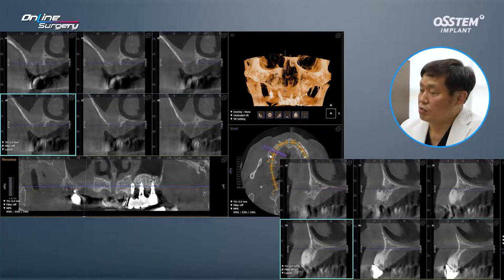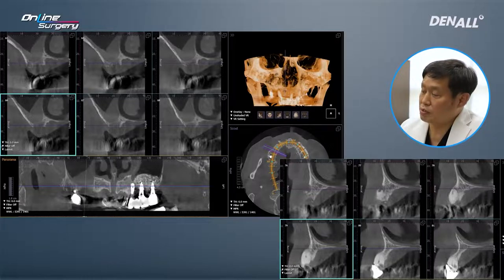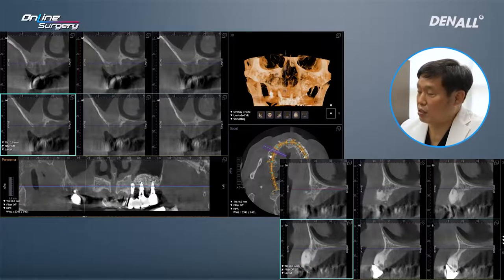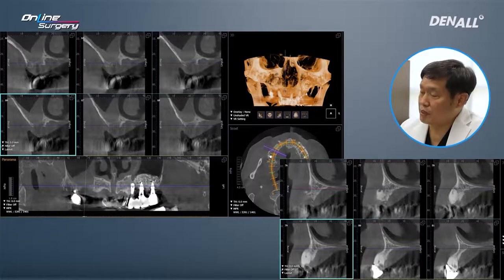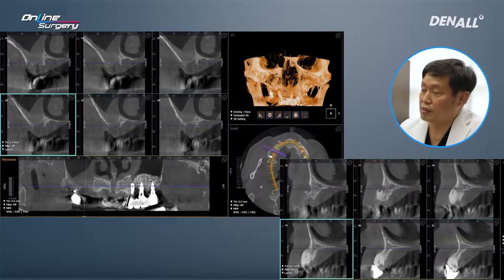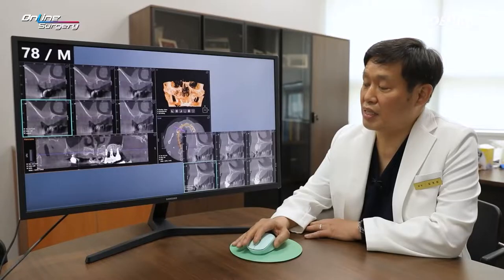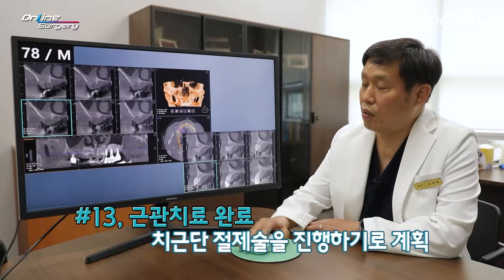Number 13 on CT — on the apex area — it's slightly protruded outside the buccal bone, and the patient may have experienced fistula from time to time. There's external resorption on the apex side. A PFM bridge existed, and endodontic treatment was done.